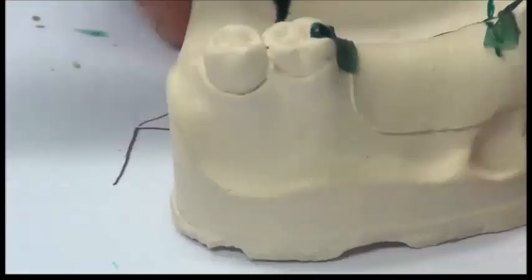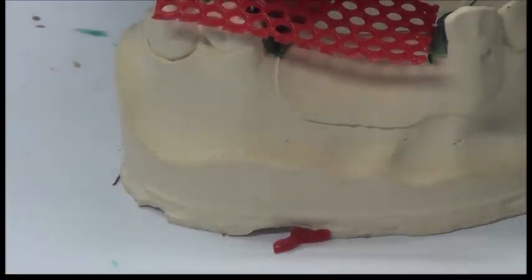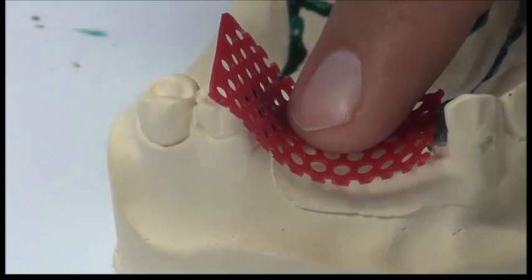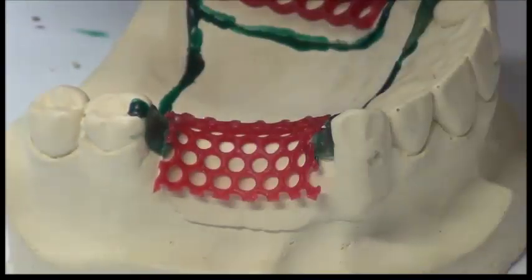For the bounded saddle area, on the upper and on the lower, in your case, we're going to place the mesh. Once more, the shining surface is downwards towards the tissue, and the other non-shining surface is upwards. Okay? I place it over the guide plane first, and then determine what I'm going to cut. I press it with a small amount of force.